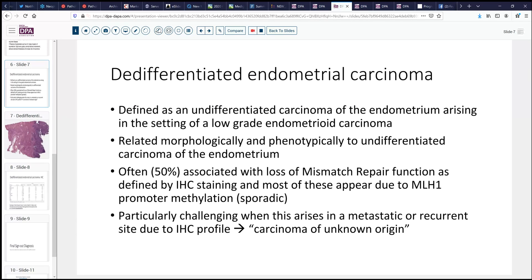In at least half the cases, these tumors are associated with some sort of mismatch repair defect, defined by immunohistochemical staining. Most involve MLH1-related promoter methylation, meaning many are sporadic changes. This is particularly challenging to recognize as being of endometrial origin when presenting at a metastatic or recurrent site, because the immunohistochemical profile is a little bit atypical for endometrial carcinoma and can pose some problems.